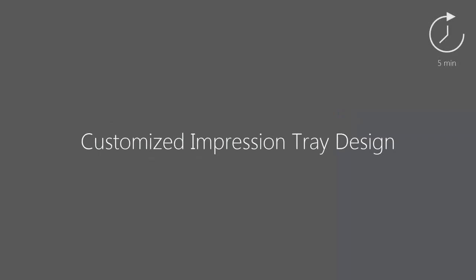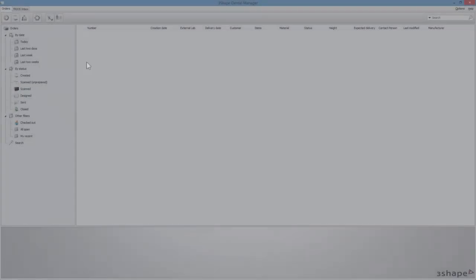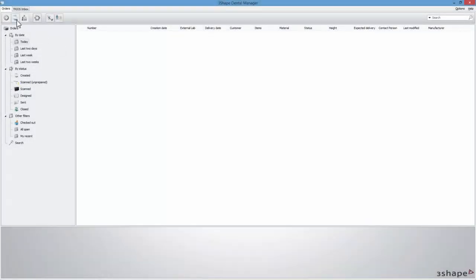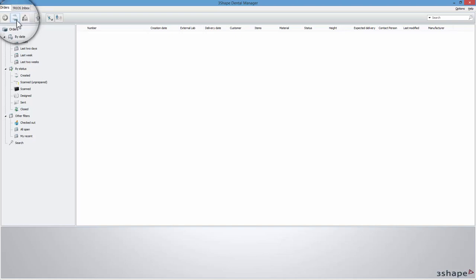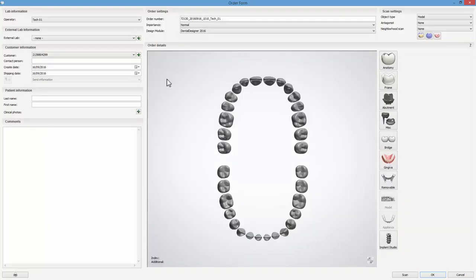In this video we will show you how to design a customized impression tray. Start by creating an order. This type of tray can be ordered either for an upper or a lower jaw. In our example we are choosing an upper jaw.